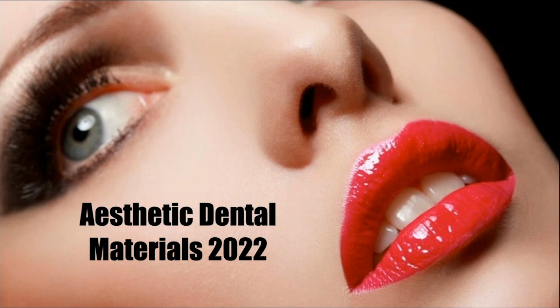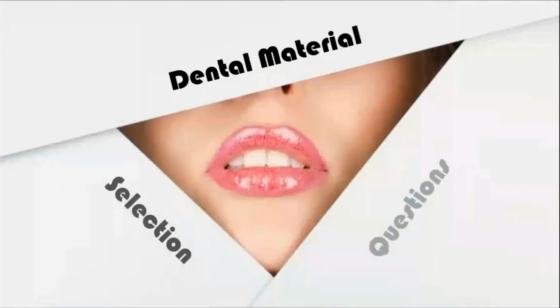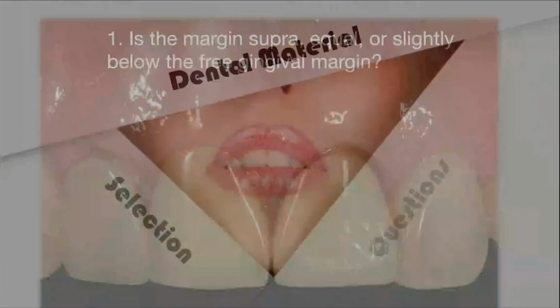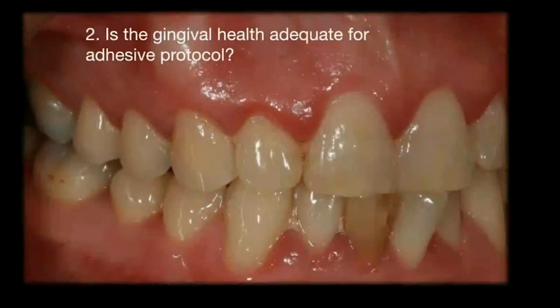Aesthetic dental materials, I say 2022, it changes all the time. I think there are so many different materials out there. Sometimes it's confusing what to pick. I think all materials are good. I think not all materials are there for the same situation. And so, some of the selection questions you might ask yourself: when am I selecting what material? You might say, is the margin supra or equigingival, or slightly below the free gingival margin? Is there something you need to hide? Is there going to be a color change? That's one of the things you ask when selecting a material.